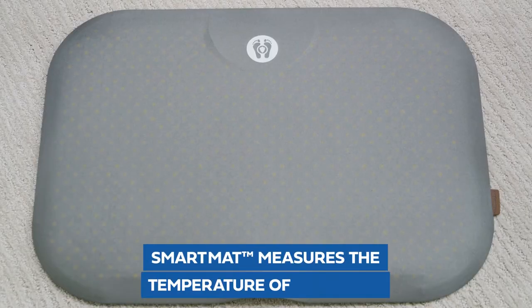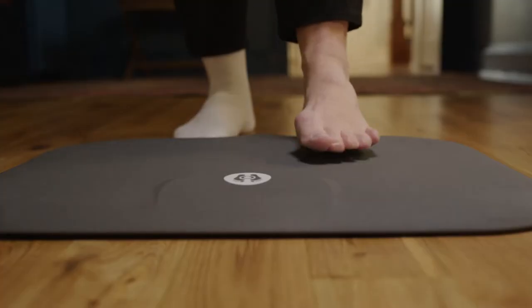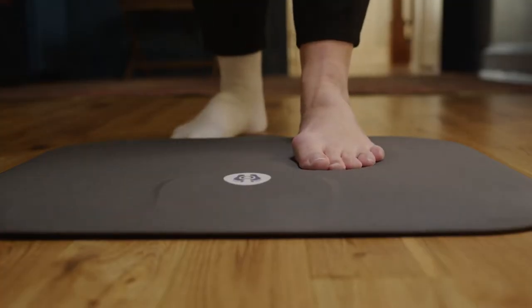The Smart Mat measures the temperature on the bottom of your feet, or on a single foot. Your Smart Mat is designed for just one user — you. Make sure no one else steps on the mat.